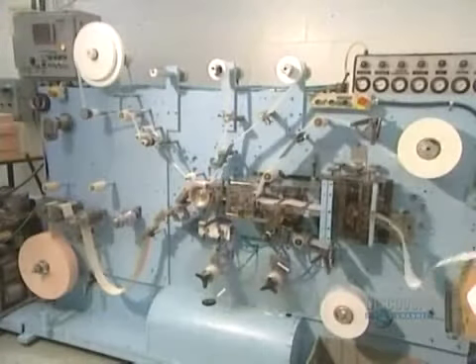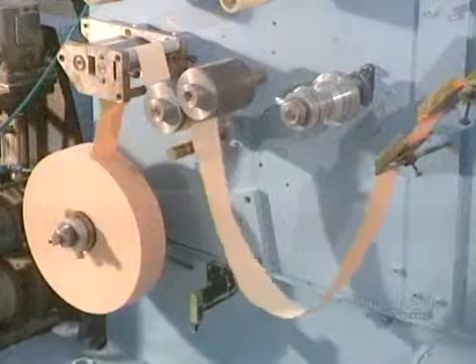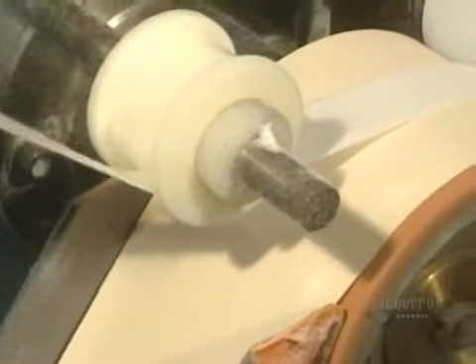The strips of cushioned fabric are now ready to be applied to the bandages. This is the machine that fabricates the bandages. The roll of bandage components is unrolled, the machine assembles them, then cuts and individually wraps them.